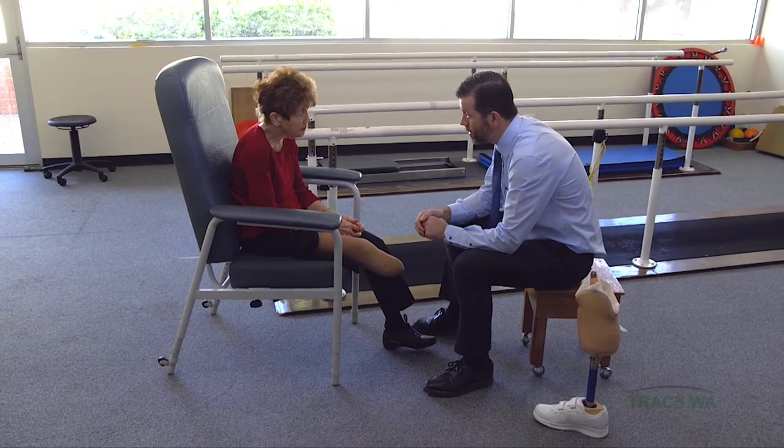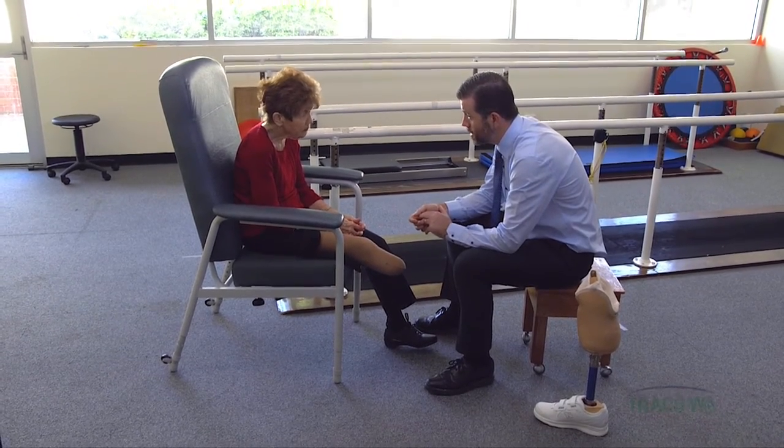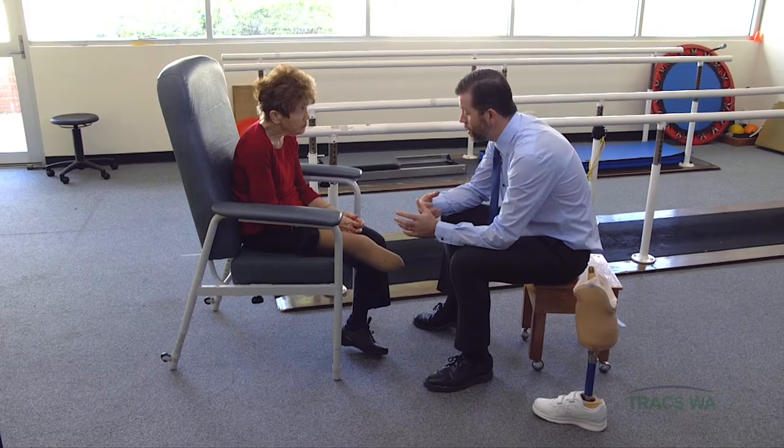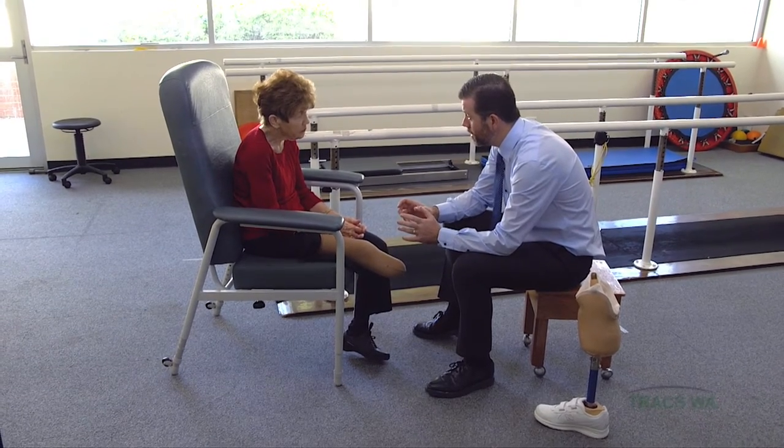What we're going to do today is take a cast of your leg to start the process of your new prosthesis. I take a plaster cast of your leg, which gives me a negative cast. I fill that with plaster to make a positive model, then change the shape of that model and smooth it up, and over that I make the prosthetic socket that fits onto your leg.